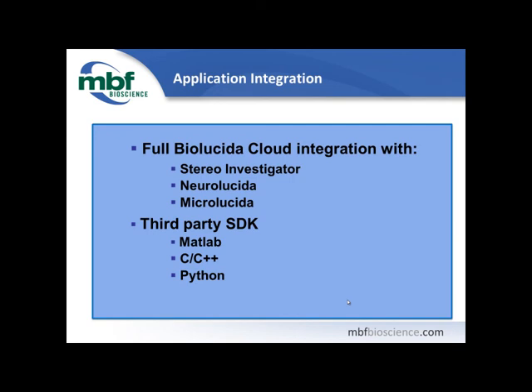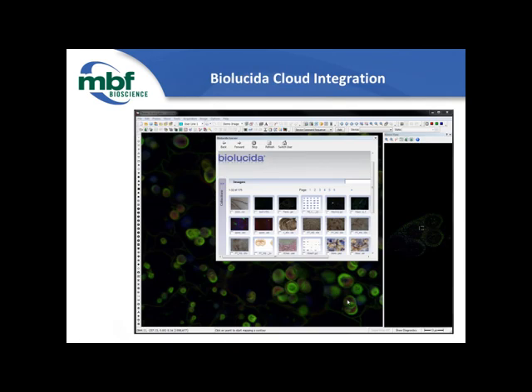Those of you that have already worked with us before know that we take our customer support and our technical support very seriously, and Biolucida Cloud support is identical as it is for all other MBF Bioscience software.